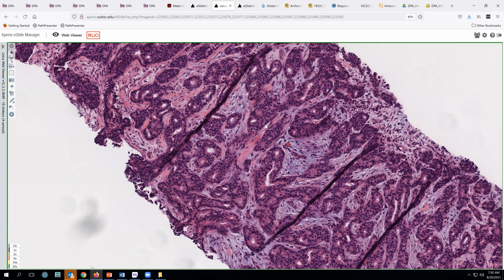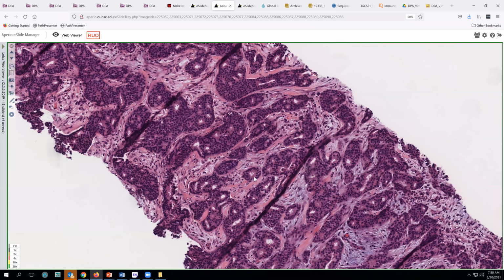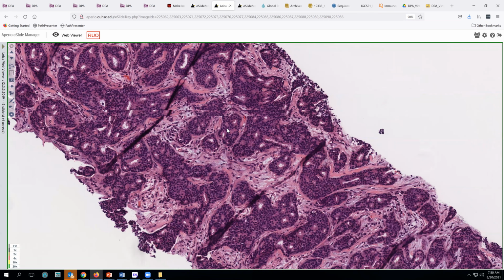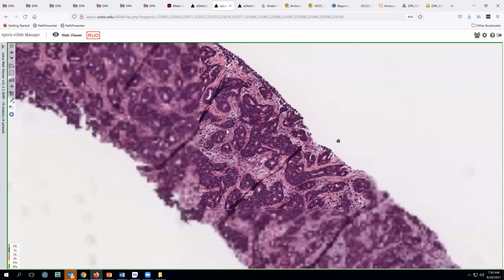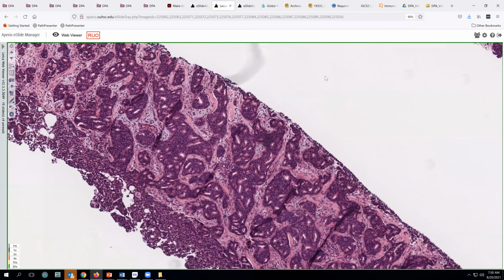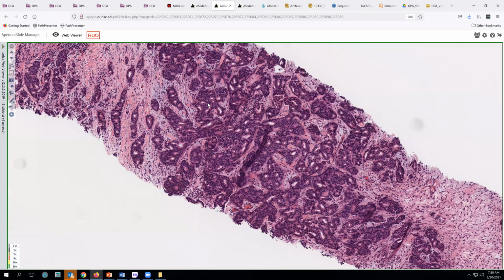So we did do a little bit of additional workup on this case. We did a CD117 and a P63, which were negative entirely, which would not be the case if it were an adenoid cystic tumor. So this case did turn out to be positive with estrogen and progesterone receptor. It had sort of ambiguous score 2 HER2 staining, and so we would reflex in that circumstance to do FISH testing. That's not back yet on this case, but I would not be surprised if it were positive to some degree, because some of these tumors can be triple positive with these markers as well.